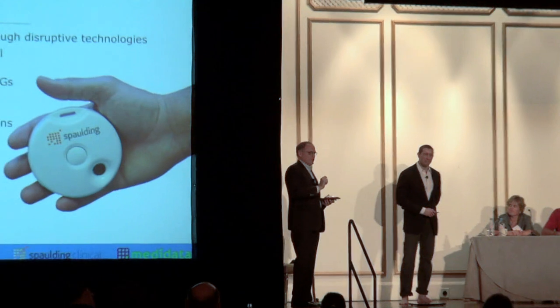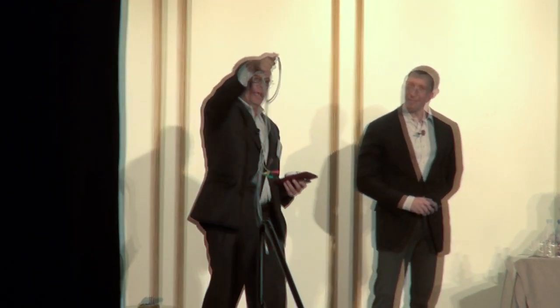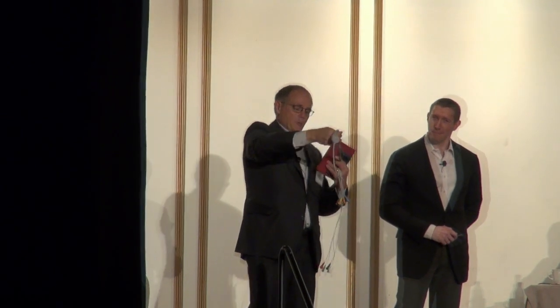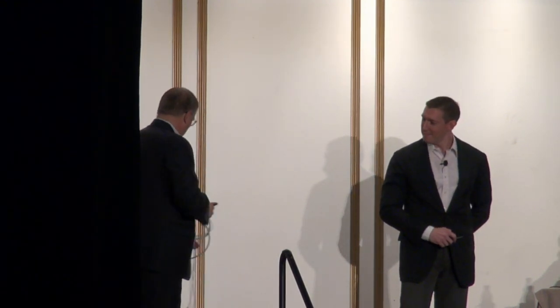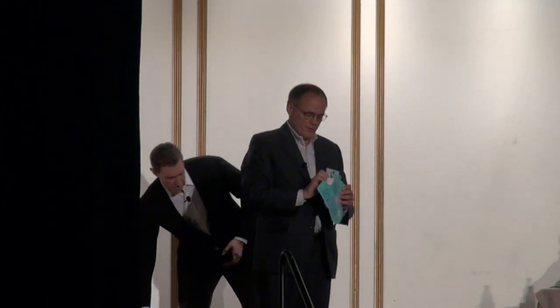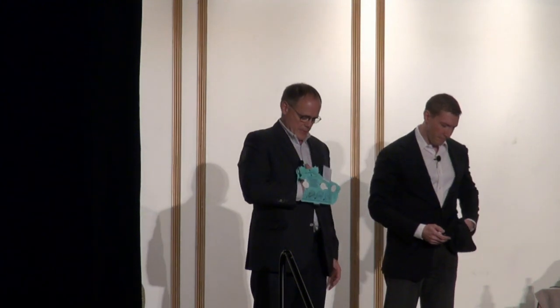The last thing I'll mention that we worked on this past year is that we took away many of the patient cables. You might be familiar with this. This is a 12-lead patient cable that a patient needs to be connected up to. While you can still use that in clinic trials, what we were really trying to do was emphasize the mobile nature of this. And so we created a lead wire set that you can self-apply. Some of you may have heard of this before. It's called the glove. It basically is a 12-lead ECG electrode set that I just align with my sternum. And then on the back are electrodes, all in the proper location. So the point being, this could be done by the patient in their home just by attaching it to their chest like this. That's pretty cool.